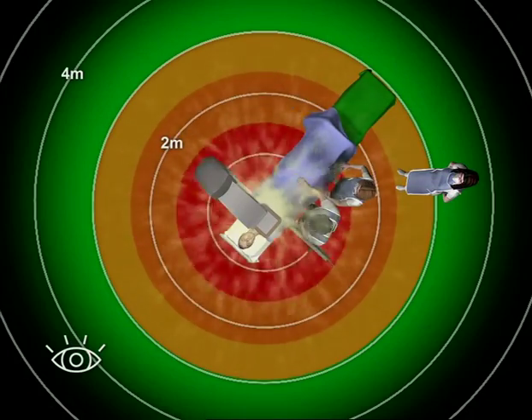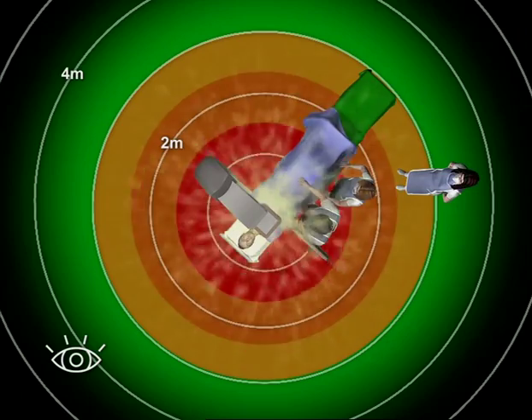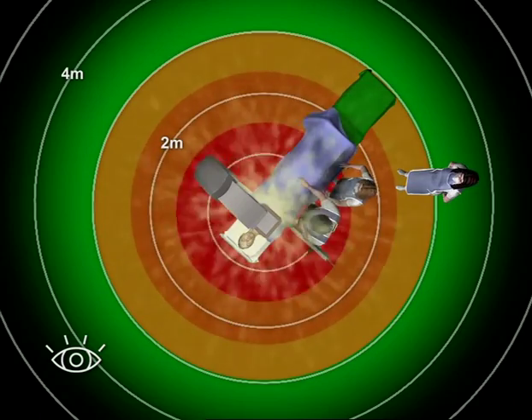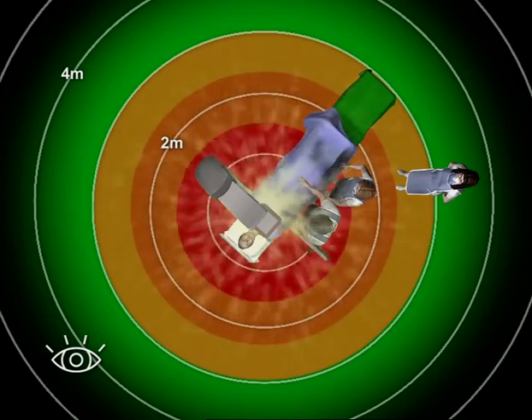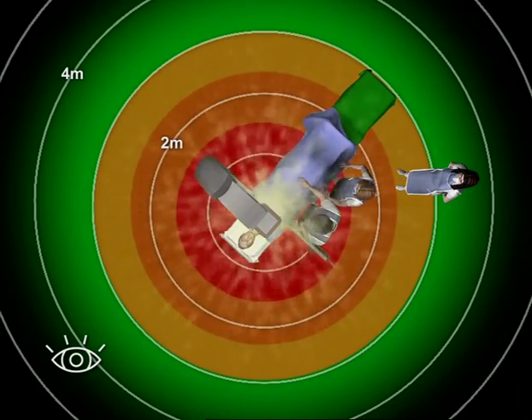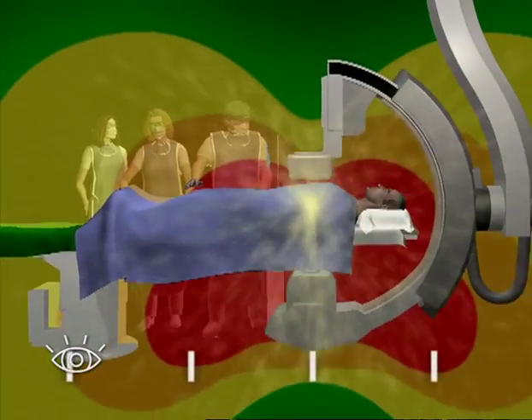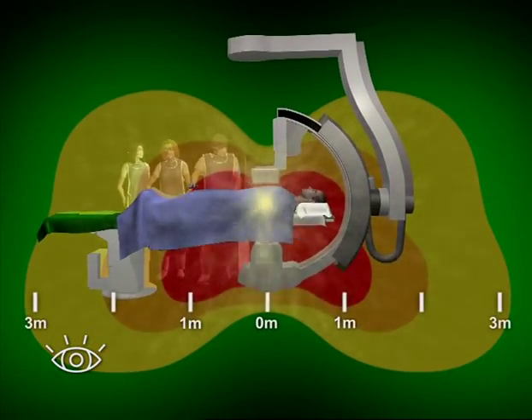Isodose curves illustrate the scattered radiation intensity in typical regions of interest, depending on the examination type and technique. Identical colors represent zones with identical radiation intensity. Scattered radiation exposure in attending medical personnel is directly linked to the distance from the radiation source. Scattered radiation exposure is significant in the red area. The scattered radiation intensity diagram shown here is obtained in the lateral view.